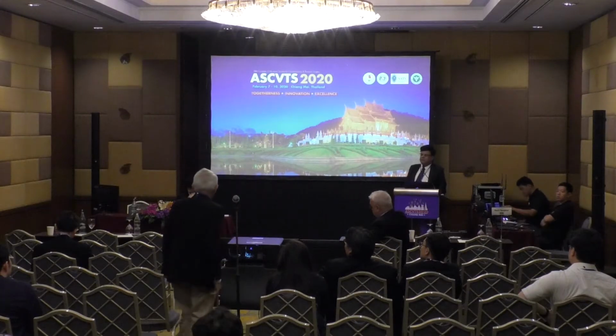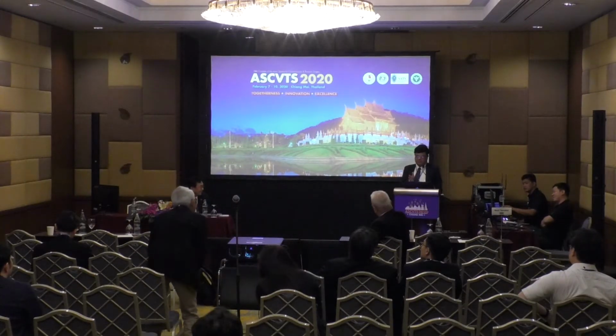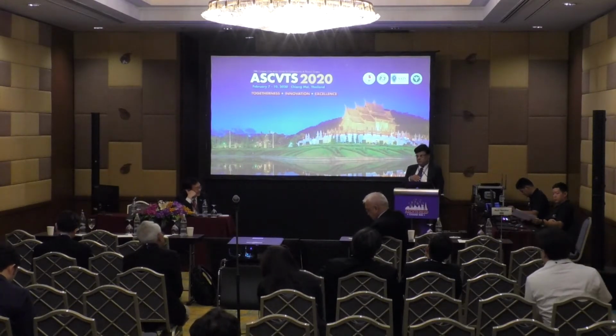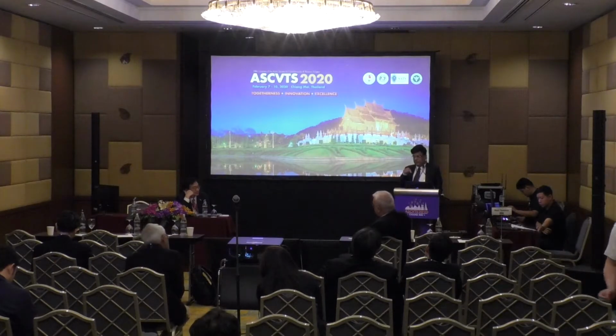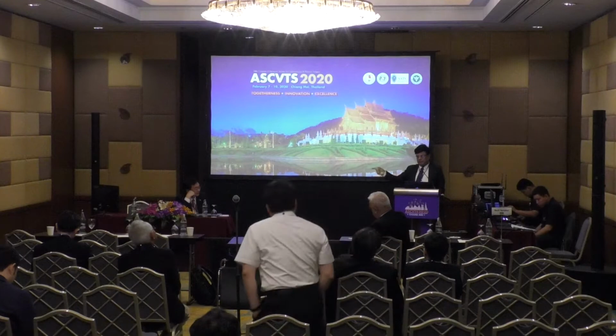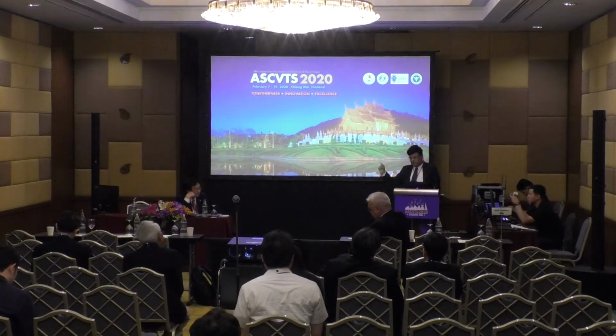Thank you. The advent of the MRI has made this assessment very easy. The problem with the MRI in small babies is that you have to sedate the child and intubate the child. The acquisition times are very long. It can be 45 minutes to 1 hour, and it's very difficult for a baby to undergo that much acquisition time.